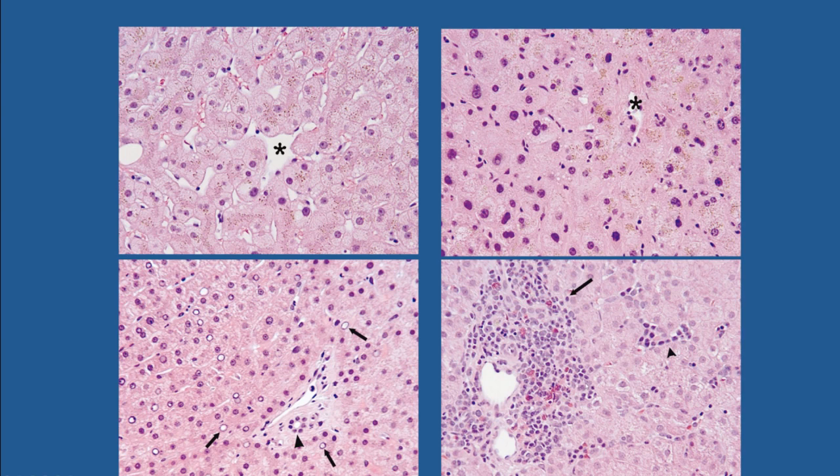Now, in this panel, we have a portal tract with a lot of cells in it, including what look like eosinophils. We also have these cells within the sinusoids. Now, almost everybody gets tripped up by these once in their lifetime. We call this hepatitis, but actually this was a pediatric patient, and it's very common to see extramedullary hematopoiesis in the very young patient.